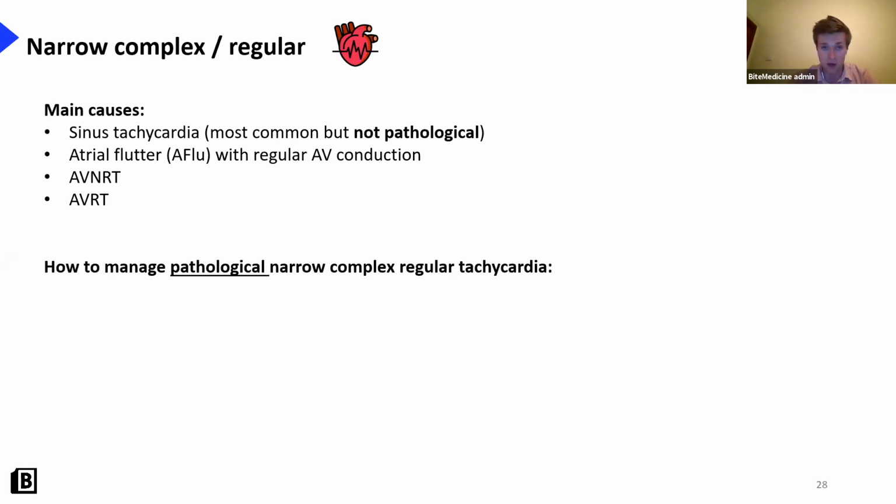How to manage a pathological narrow complex regular tachycardia, I want to run through first. And then I also want to briefly mention how to spot a sinus tachycardia, because I think that's really important. And as an F1, it will be something that you're expected to be able to do, or at least have a go at before running to your cardiology registrar.